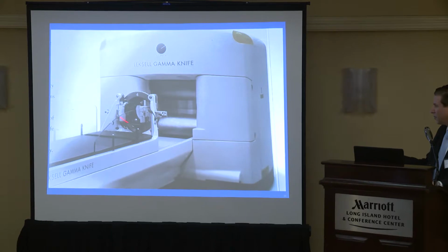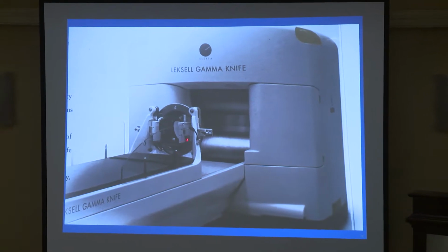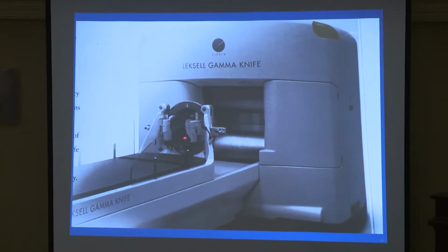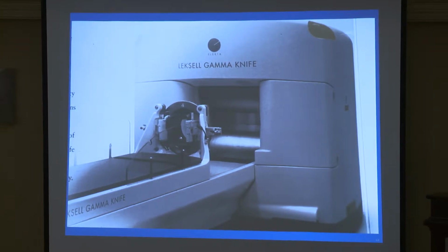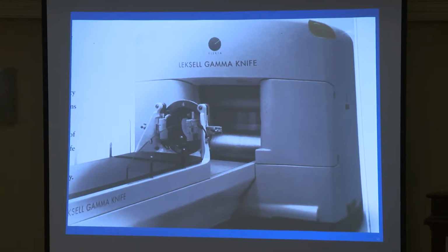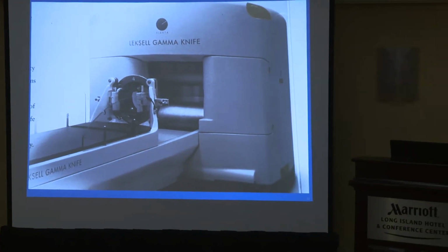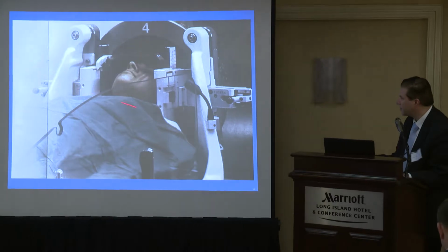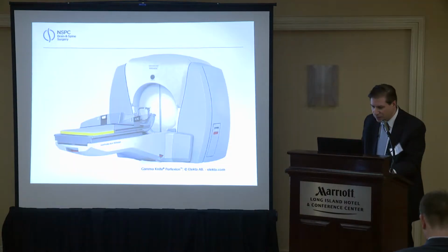This was a machine that we got originally here on Long Island about 16 years ago. This was the Gamma Knife, and one of the earlier designs here was where the person would be secured here, and then this was actually a big innovation at the time, this Model C, where there was a machine here that automatically moved the person to different isocenters. To make up a complicated shape, you might take an isocenter that looks like a sphere and then add a bunch of other isocenters that are spherical until you shape it into whatever size or shape you want it to be. But that allowed for much faster and more complicated treatment plans. And this is a picture of the person who has their head frame on. This is the automated machinery and was about to go into the machine.